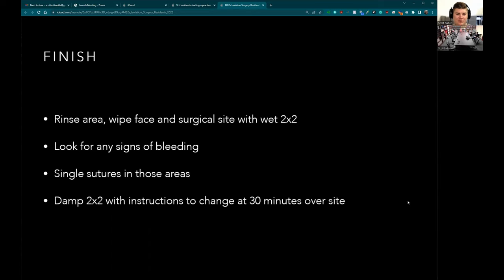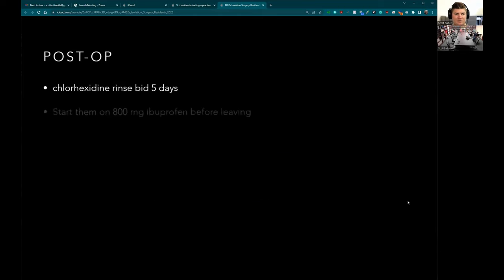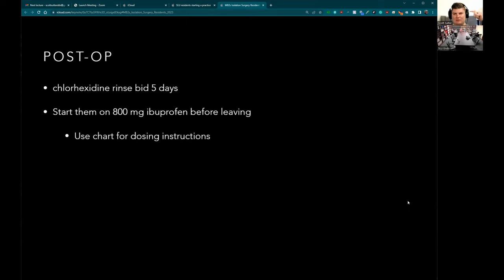As far as finishing up: rinse them, wipe them off, look for any signs of bleeding, and do single spot sutures if needed. I put a damp 2x2 over it with instructions to change after 30 minutes to absorb any blood — but usually by this point there shouldn't be any. I do use chlorhexidine post-op — I know it's controversial and can slow wound healing, but I've done it forever and it helps when patients don't do a great job cleaning. Start them on ibuprofen before they leave. We always use Marcaine so they're numb for a while — use the alternating ibuprofen and Tylenol schedule on your post-op sheet.